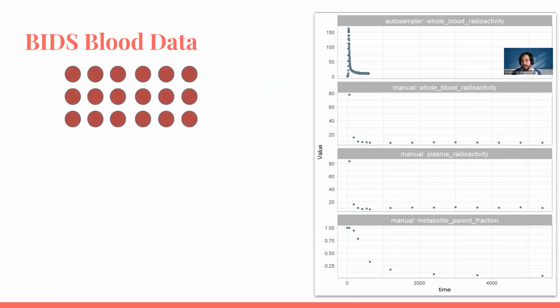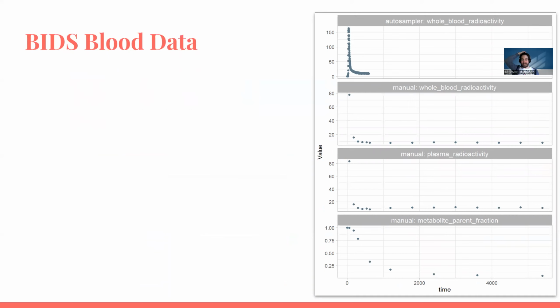So the first thing to say is, if you're an analyst and you get this data from your chemists, as I have been, and I was handed this data, and I would sort of complain, oh, it looks a little bit noisy. Just know that a lot of work has gone into this, and there's been a lot of running around, putting things into tubes, taking things out. So we can't expect things to be perfect, because it is lots of different steps and lots of different analyses. So when we get the data like this, it's already a miracle that it's on our desk. Be happy, and let's try to do as best as we can with it.